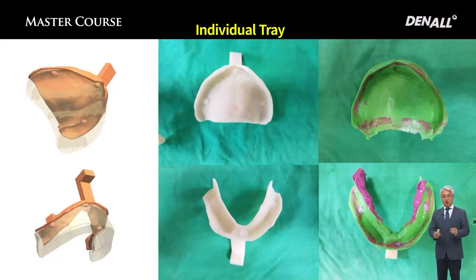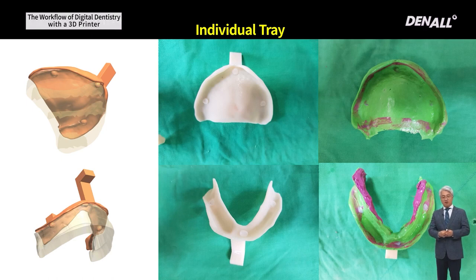In the past, manually, individual tray or recording base was made on the model. After that, it was delivered to the patient, impression was taken, VDCR was checked.